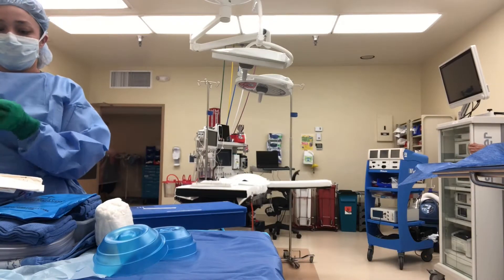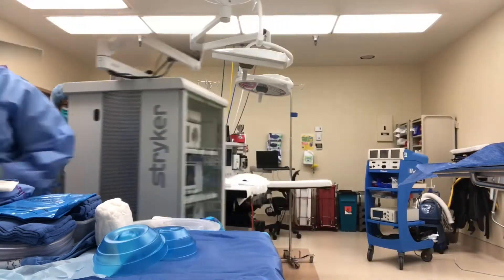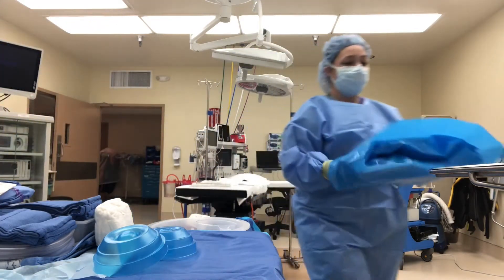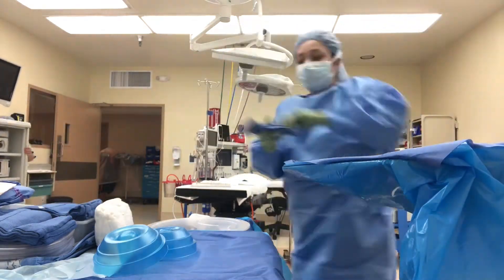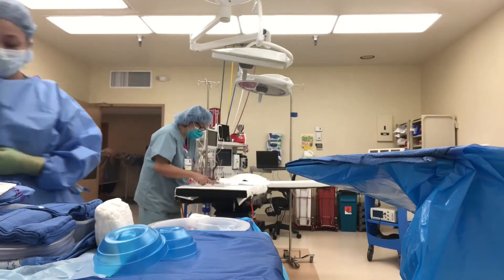Here I am gloving up. I decided to skip the portion where I gown and glove because I have already done a video on that. Now I'm going to be setting up my Mayo stand. The Mayo stand cover has two slots — it says where your right and left hand go, and you just slide it over the Mayo stand. I reinforce that with the towel just to make sure nothing sharp breaks through it and nothing will get contaminated while in the case.